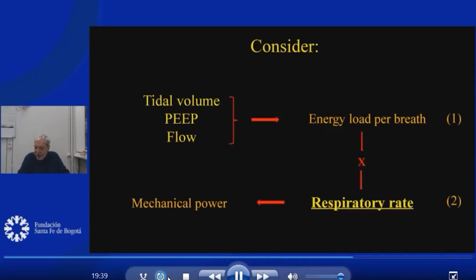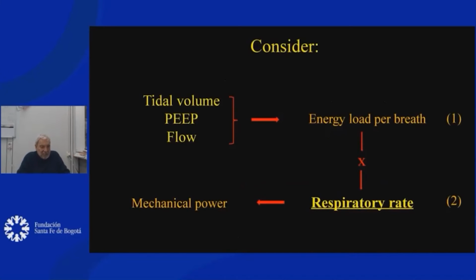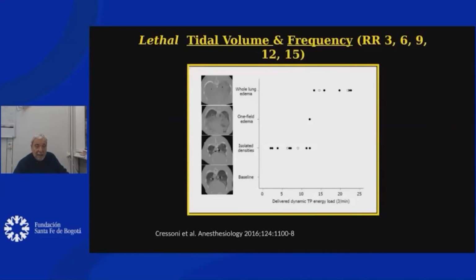If you look also at the ALMA study, using a respiratory rate of 15 or 25 or 30 is quite equivalent. Now, if you have a hammer, try to hit your hand once per minute or 30 times per minute. The damage is different. So it's very common sense. All this put together is the mechanical power. This is an example of how energy is important. The respiratory rate is important.